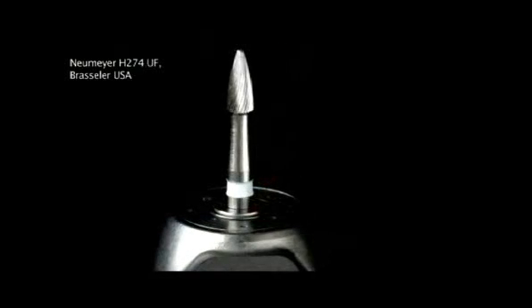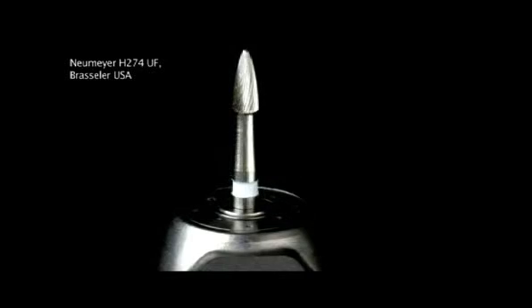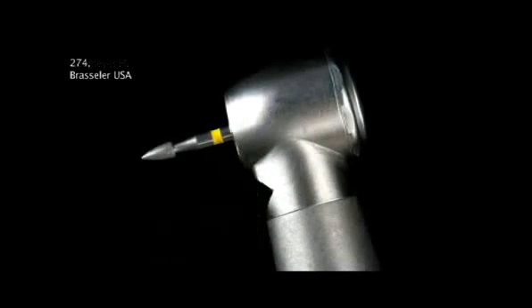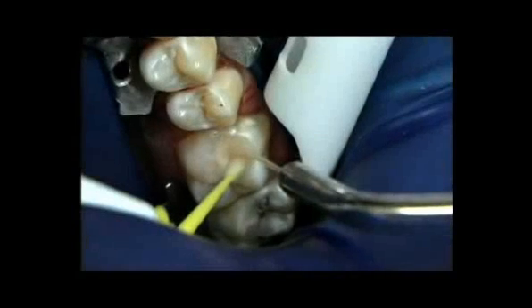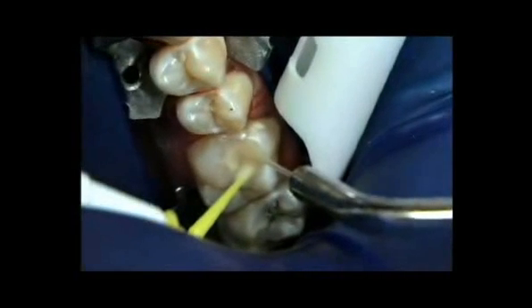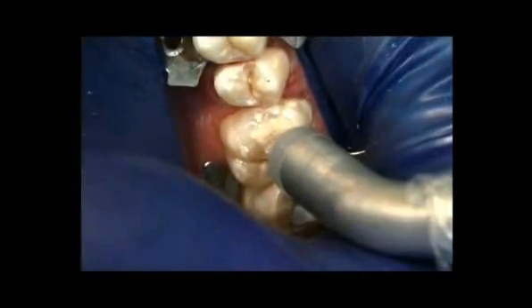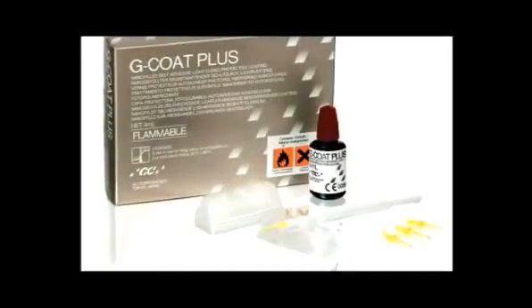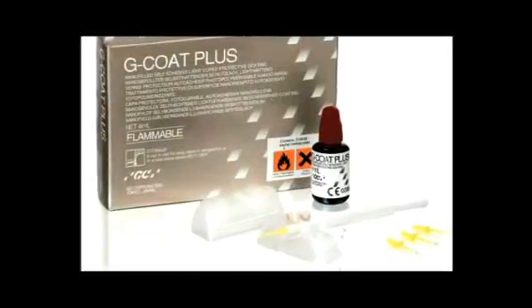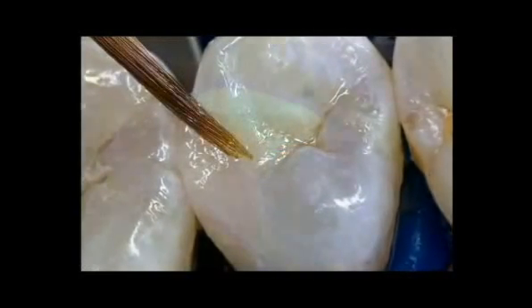A smoother surface can be achieved by using sequential finishing with a 30-fluted tapered finishing bur or an 8-micron tapered diamond bur under water spray. After finishing, rinse with water to remove any surface particles or contaminants and thoroughly air dry with a warm air tooth dryer by ADEC. A thin layer of G-Coat Plus by GC America was applied with a sable brush or a micro tip applicator and light cured for 20 seconds.